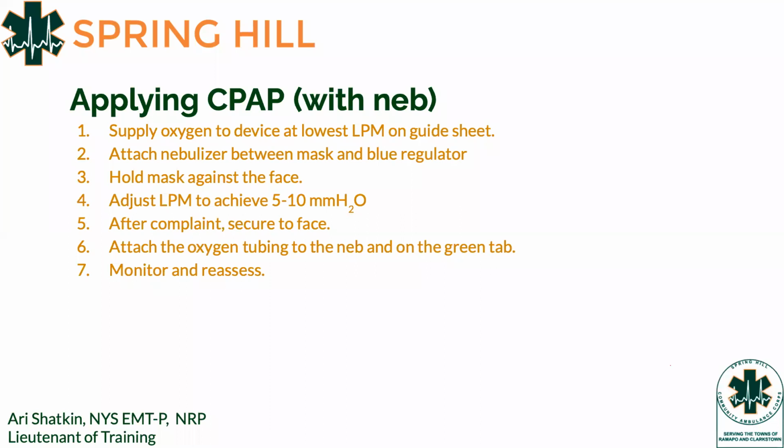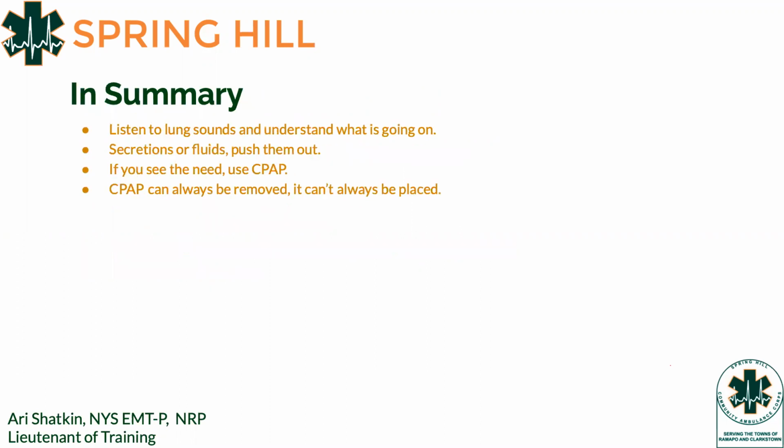After you're sure they're compliant, secure it to their face, and then attach the oxygen tubing to the neb on the green tab, which we'll look at shortly. All right, and then you're going to monitor and reassess and make sure it's working.